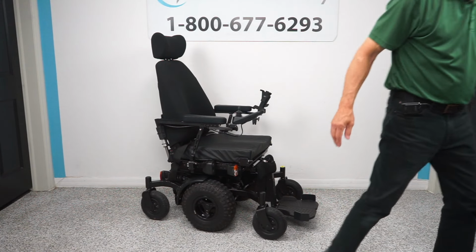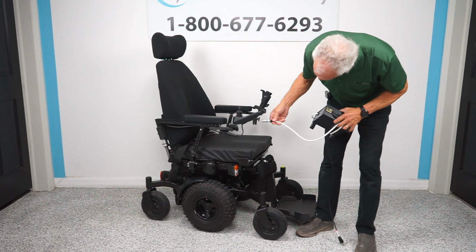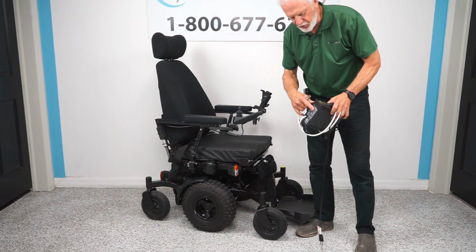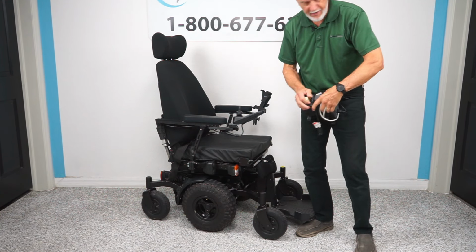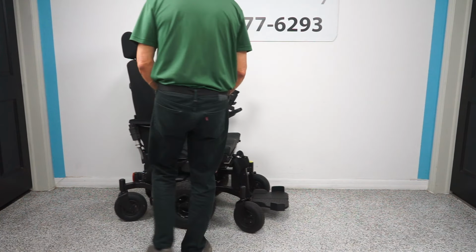When you charge this chair, now this is not the charger for the chair, but it'll work on this one. We'll just show you where to plug it. Right here is where you plug it, and as soon as the light goes from orange to green, it's fully loaded, okay? Sorry, fully charged.